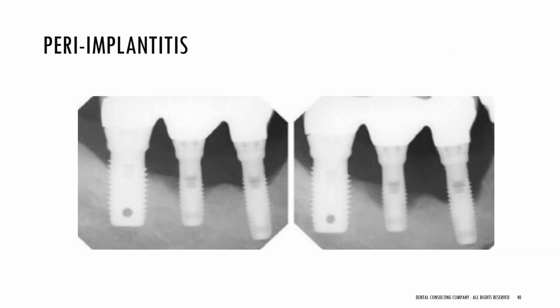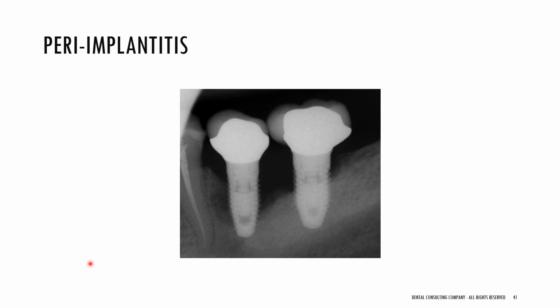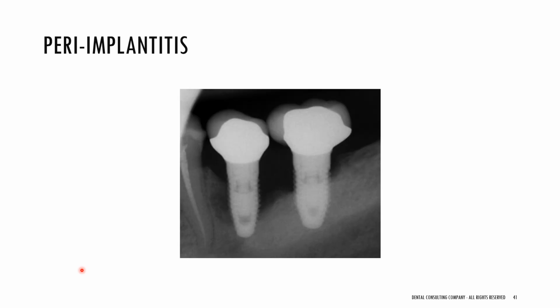Here is an image that shows the progression of disease from the left image to the right. Here is another change in the bone support around the implant, which makes this patient peri-implantitis.